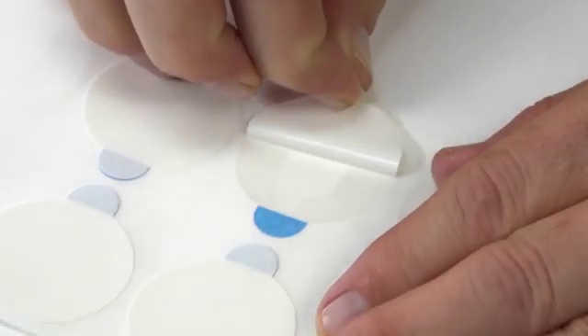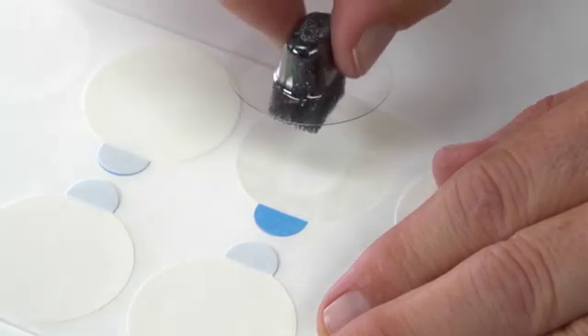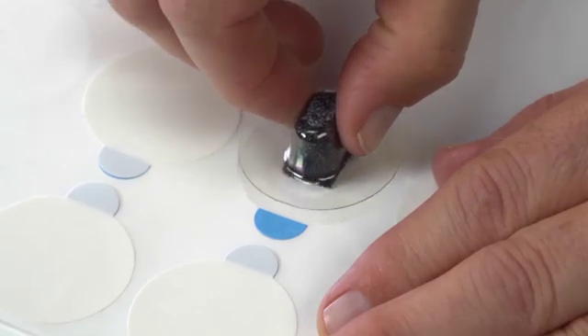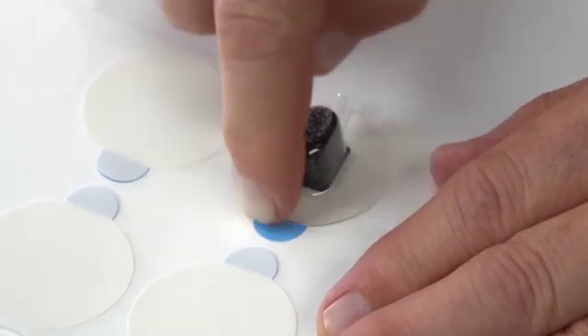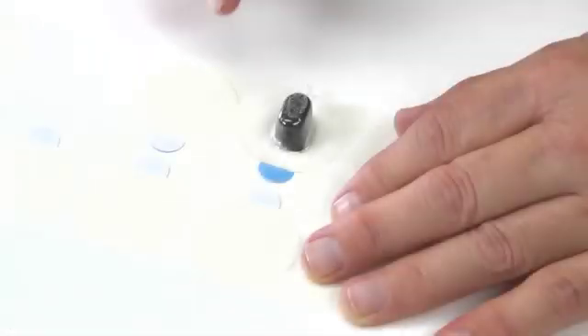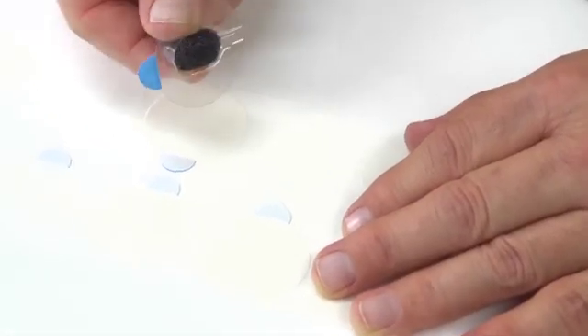Remove the adhesive backing from one side of the horseshoe-shaped adhesive ring delivered with the 8000H sensor holder, and apply it to the clear holder so a slot is open for the sensor cable. Then remove the adhesive backer from the other side of the adhesive ring.